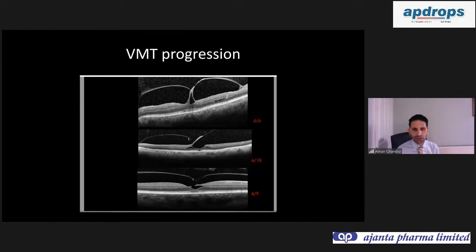And you can see this. Here we have huge distortion of the foveal anatomy caused by this vitreous pulling on it. And this person had good vision. And then actually you can monitor this. Their vision deteriorated here because you can see it pulled part of the fovea off. And then eventually, as that hyaloid or vitreous pulled off completely, their vision improved and their anatomy improved. It's very nice to watch the progression of vitreomacular traction, or VMT, with OCT. This is not possible with clinical examination, and really you must use OCT for this.